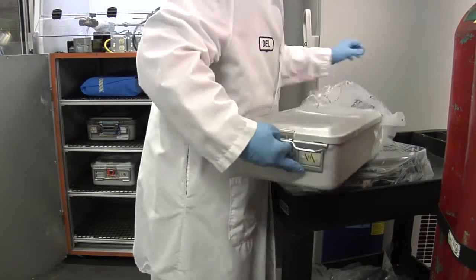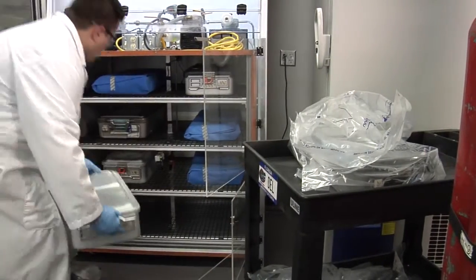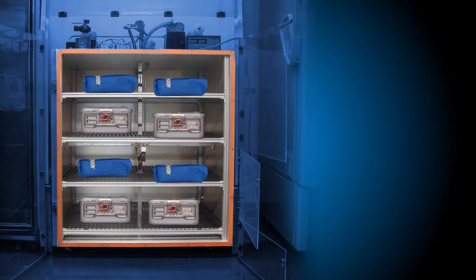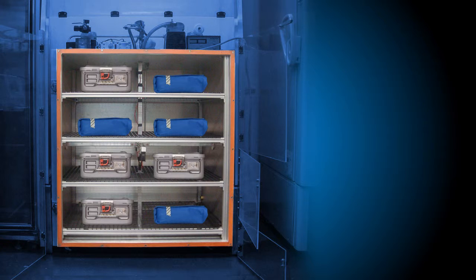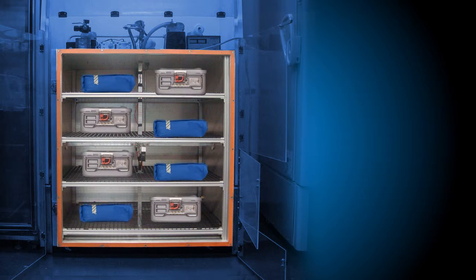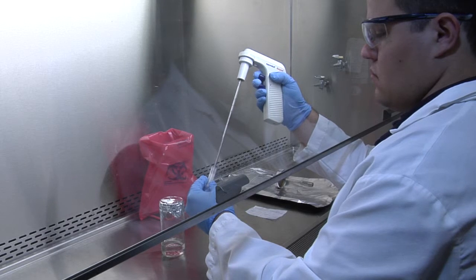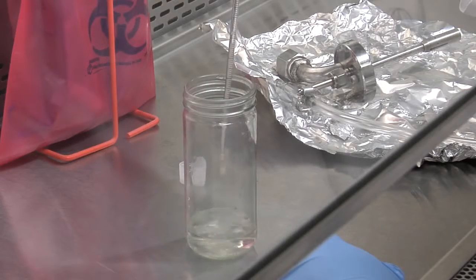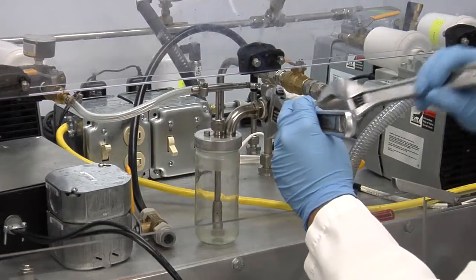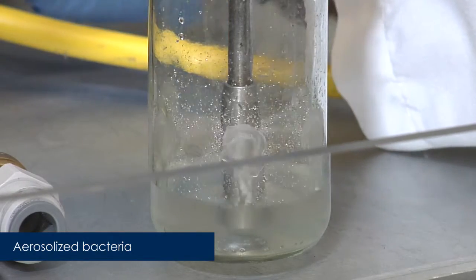In the ARA lab, sterilized packages with membranes were removed from their sterility maintenance covers and placed in the bioaerosol test chamber. Eight packages were tested at a time, rotating position between tests so that packaging types were tested in all eight locations within the chamber. Frozen bacteria were thawed, diluted in water, and placed in a sprayer. The sprayer was then connected to the test system, and aerosolized bacteria were sprayed inside the chamber.